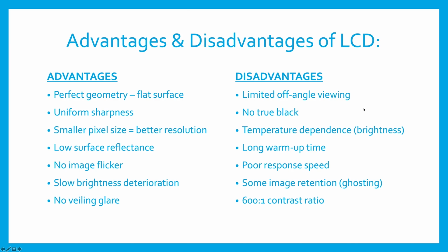Again, some of the advantages and disadvantages, I put this on here. The biggest disadvantage to an LCD is that it has a limited off-angle viewing. The other thing is it doesn't show true black. It's also temperature dependent, and it has a warm-up time. So you have to actually warm this up for about 10 to 15 minutes in order for the radiologist to start diagnosing. So it has a slow warm-up. And then some of the image retention can cause ghosting, which is not good when you're trying to diagnose an image.